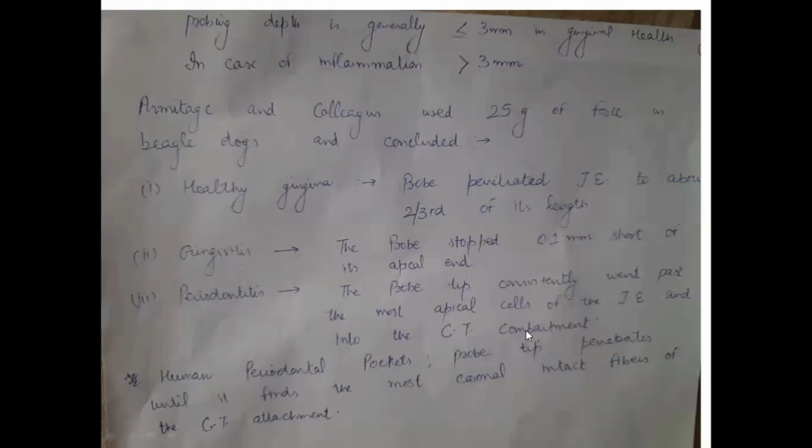But when there is inflammation of the periodontium, when the connective tissue is inflamed, when the connective tissue fibers are being destroyed, then the tissue cannot offer more resistance. So the probe tip goes consistently past the most apical cells of the junctional epithelium, and it goes into the connective tissue compartment. In human periodontal pockets, the probe tip penetrates until it finds the most coronal intact fibers of the connective tissue attachment. Now, what are the factors which affect the probing?